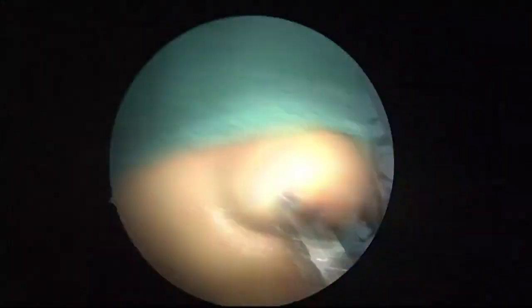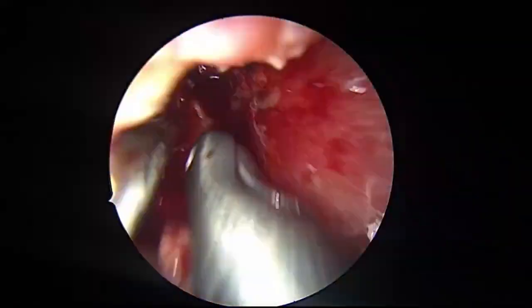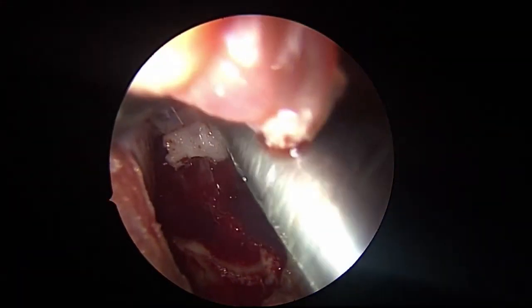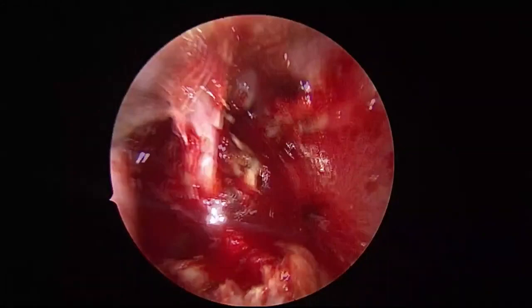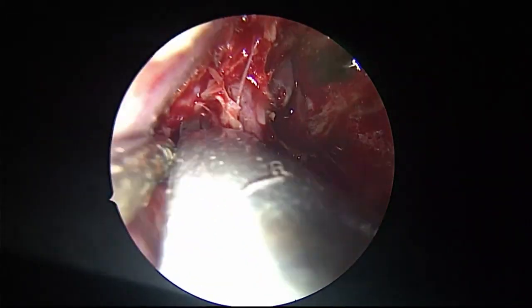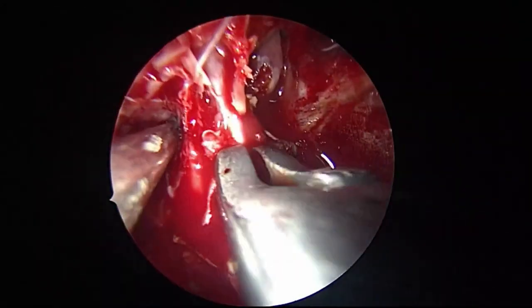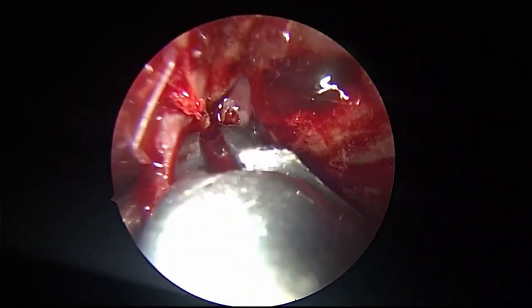Suction. That is the nasolacrimal duct. That is the upper part of the duct, you see. Now see, this is the level of the floor of the orbit. Can you see? At this level I'll remove this bone. I'll cut the duct at that level, flush to the orbital floor.